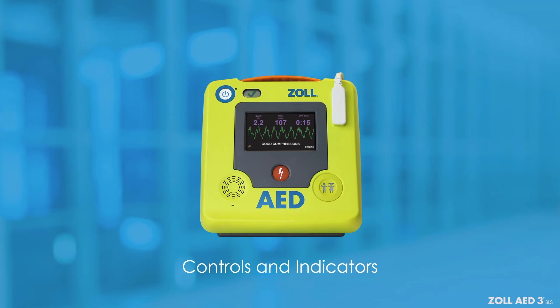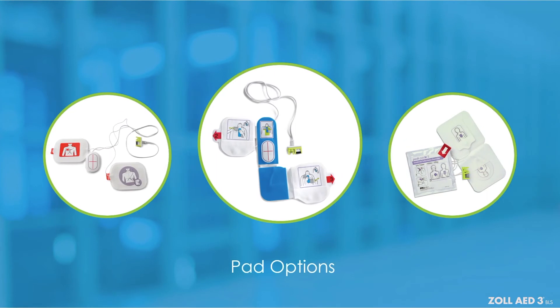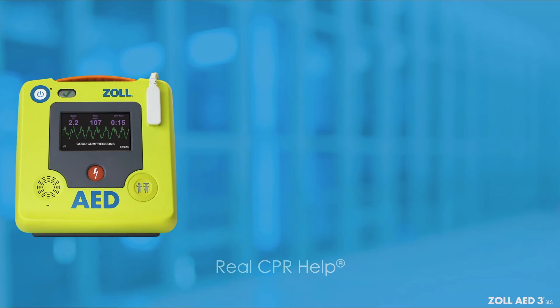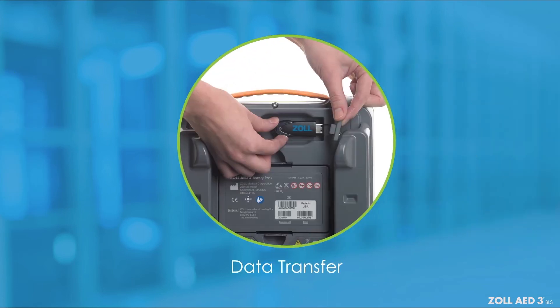Controls and indicators. AED electrode pad options for the adult and child. And performing CPR with our CPR dashboard and real CPR help technology. We will summarize all the steps in a rescue, and then review data transfer in the AED management non-rescue mode.